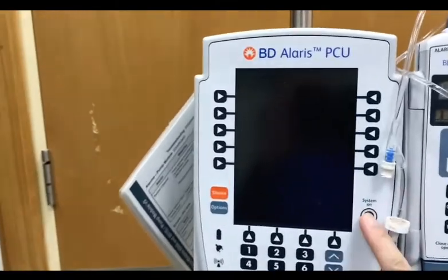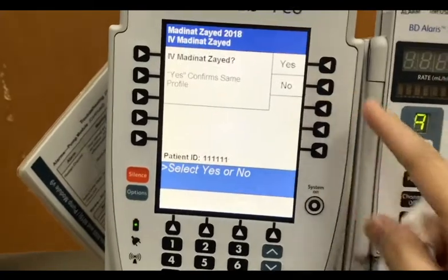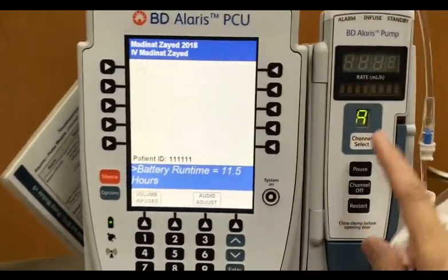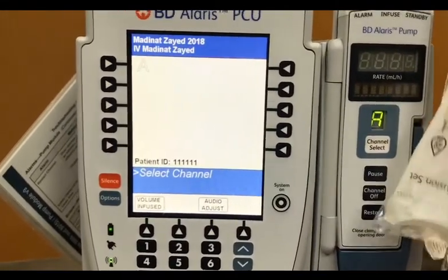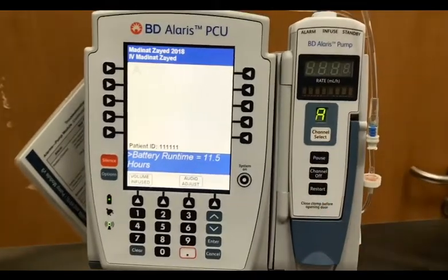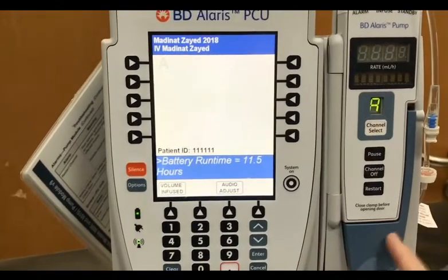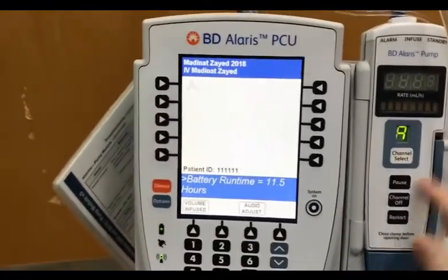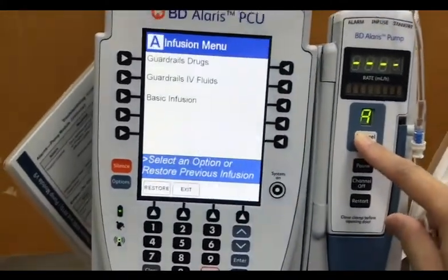So again, let's go to the system on. We are on the same patient, so no, it's not a new patient. Still the same hospital. Yes, confirm. Now again, channel select, press wherever this one, which channel, because you can put a lot of channels, even 4 or 5 channels. So one channel, even 2, 3, 4, a lot of channels that we can put. Yes, press the A channel.